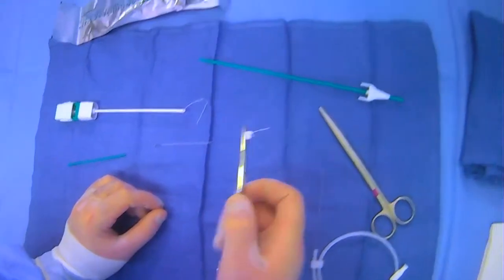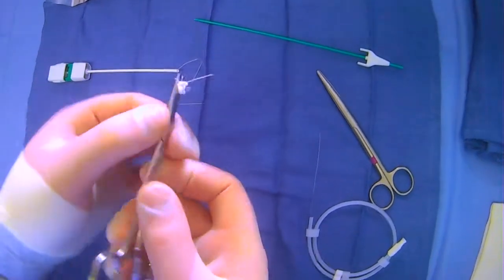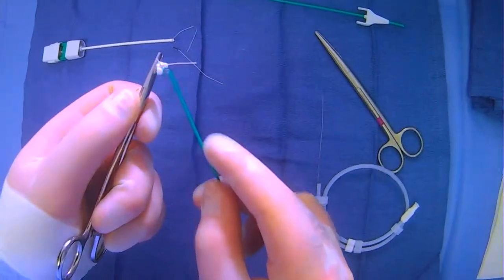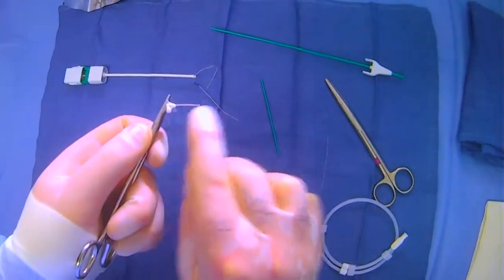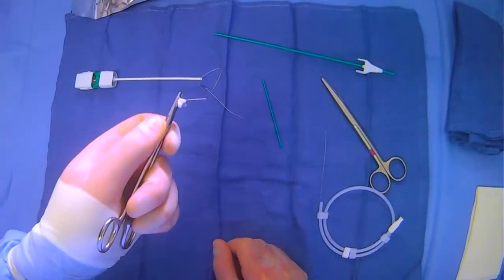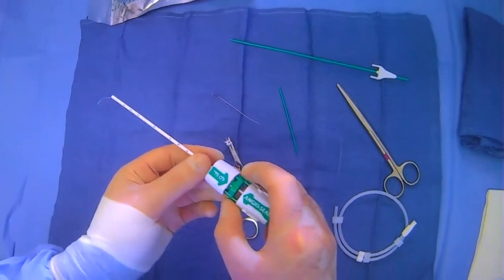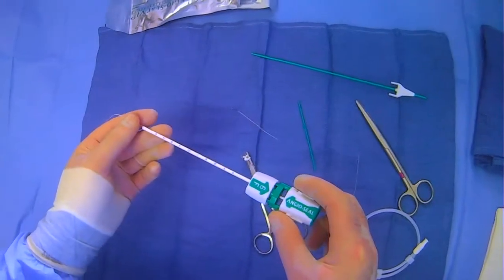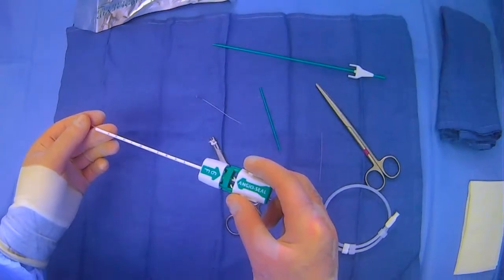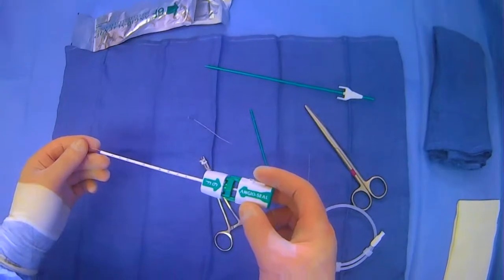You'll have your suture sticking out. Go down low, flush with the skin, and cut. You'll have your anchor inside the vessel, your collagen plug just outside the vessel, and the suture cut flush with the skin — and that will give you hemostasis. This shows the different kit components, and we'll do a more representative example in one of the other videos.